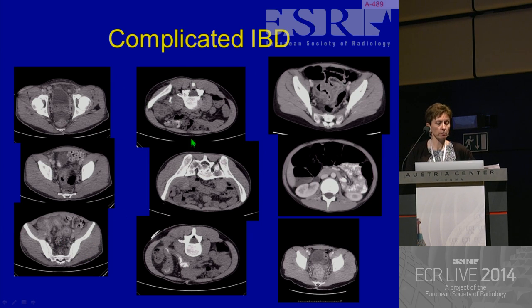This is another patient. They were scanned prone. I didn't just put my pictures in upside down. This is a patient who had a psoas abscess due to a fistula, known Crohn's disease patient. And you can see the pigtail catheter in situ here, which had virtually drained the psoas collection. But the patient's fistula just didn't appear to be healing. This drain continued after weeks to still drain.